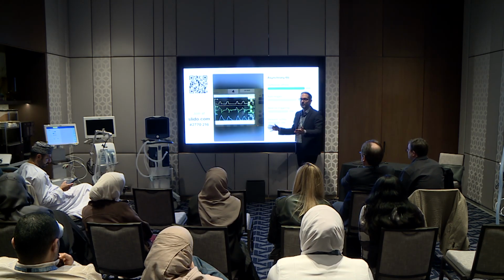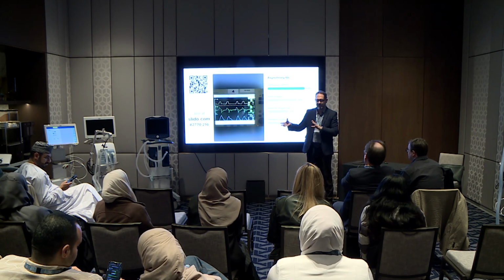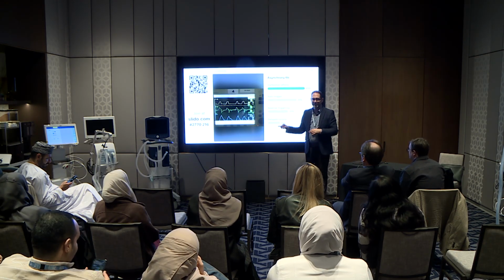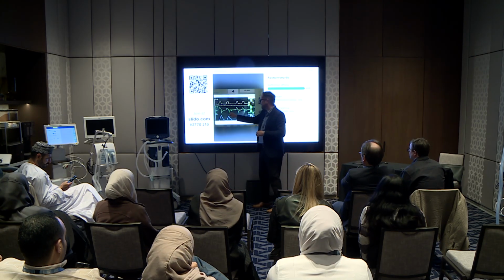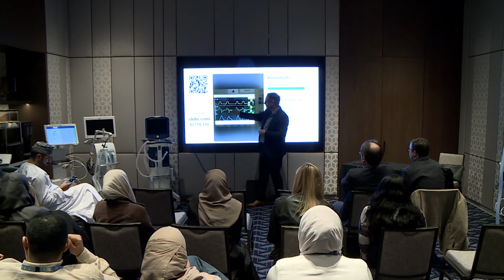So again, remember, with reverse triggering, the ventilator gives the breath to the patient first. The patient's not demanding it, the ventilator gives the pressure, and the patient responds with a reflex. When you have auto triggering, the ventilator is giving it no matter what the patient wants. So what's happening here, I wouldn't say this is classic reverse triggering at all, but there's a lot of pressure fluctuations, there's a lot of flow fluctuations.